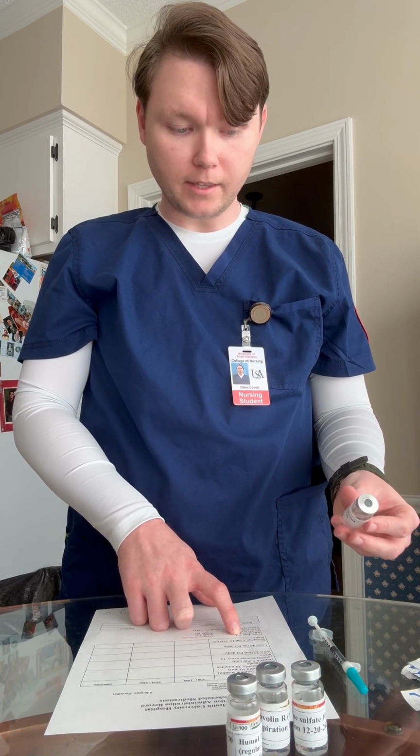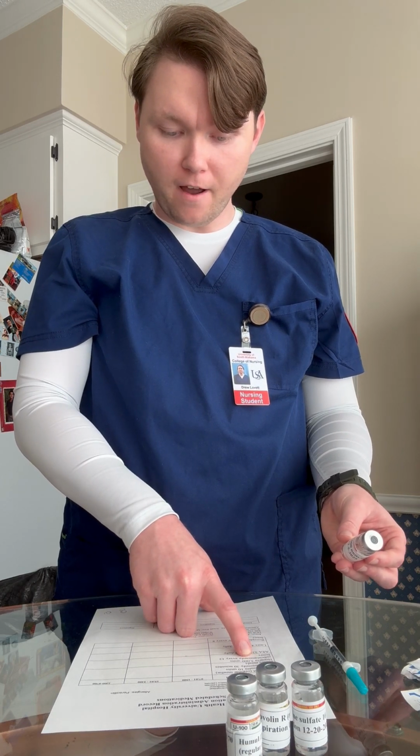Okay, so now I'm going to start my second check of accuracy. So, right patient, Jaguar J. Jones. Right medication, I have a vial of heparin that has 10,000 units per milliliter, and I have an order for heparin 5,000 units. And I've drawn up 0.5 of heparin in this syringe, which is 5,000 units.